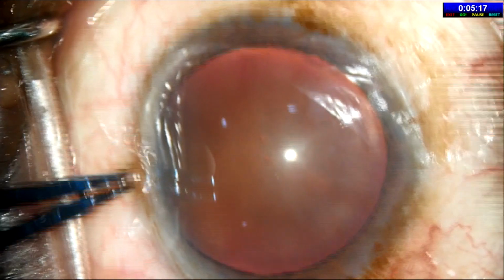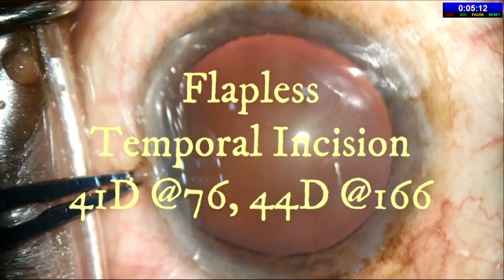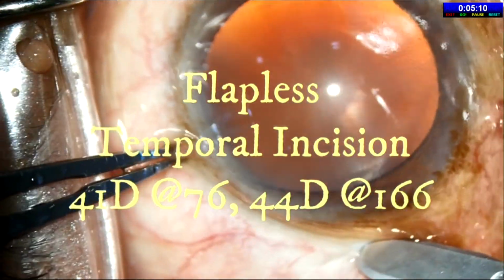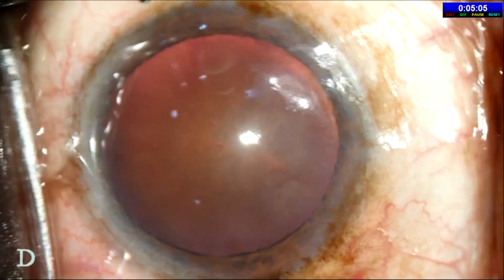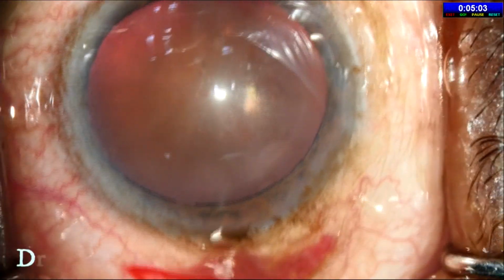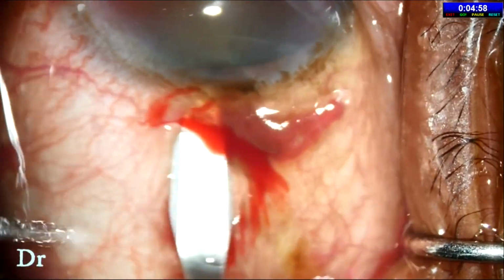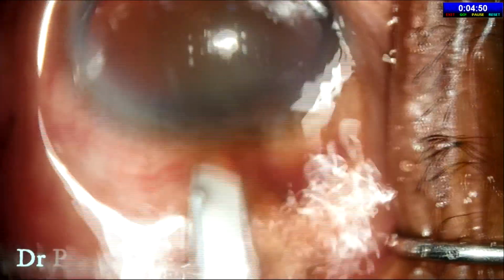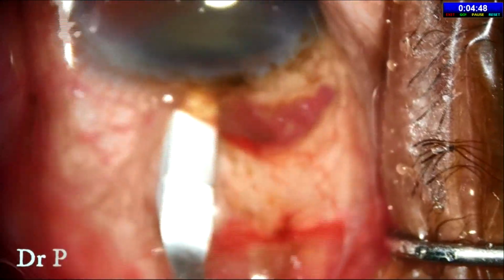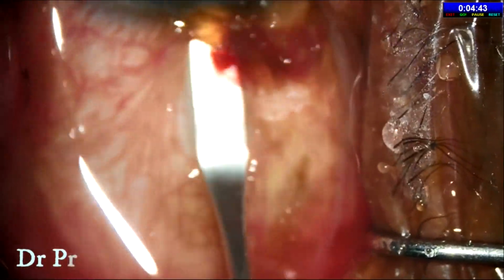It's topical. And it's transconjunctival, and I'm doing a modified customized incision because the steep axis was temporal, so I'm doing a temporal incision. Initially this part may be difficult for beginners, especially under topical, but once you achieve the second plane, then things are absolutely smooth. And it's just a matter of practice and patience.